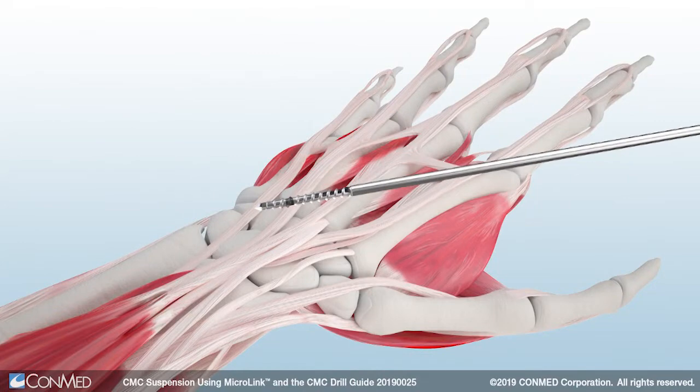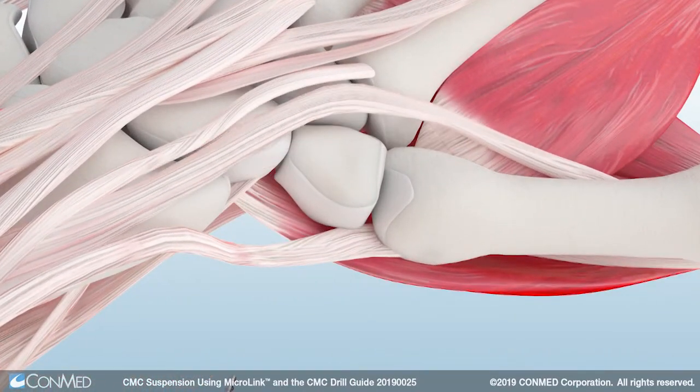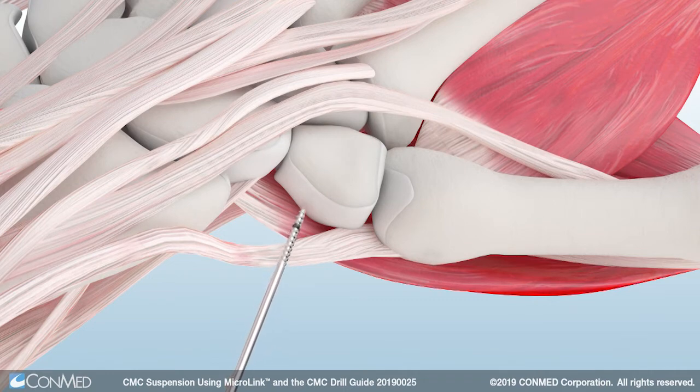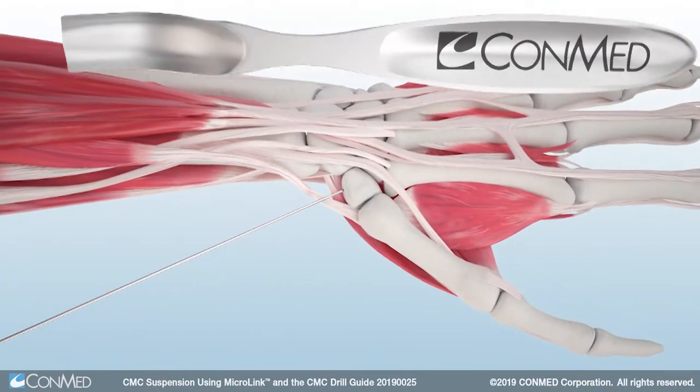The trapezium pin offered in the Microlink system is used to assist with trapeziectomy. Use a pin driver to drill the trapezium pin into the center of the trapezium up to the laser line indication of 10 to 15 millimeters.